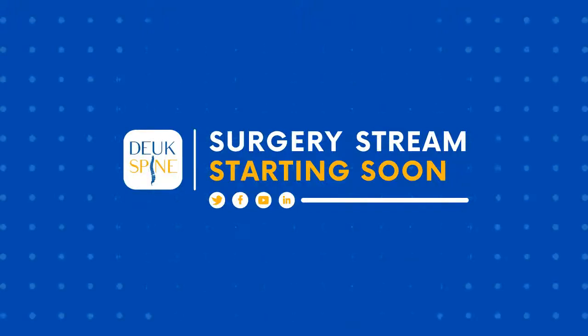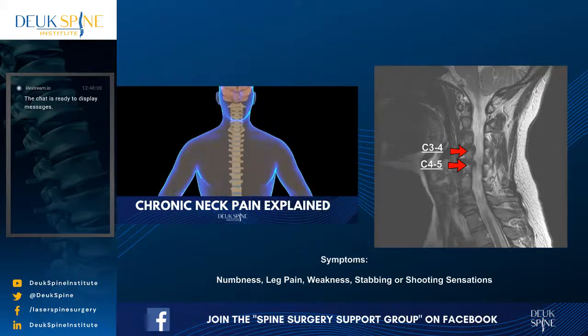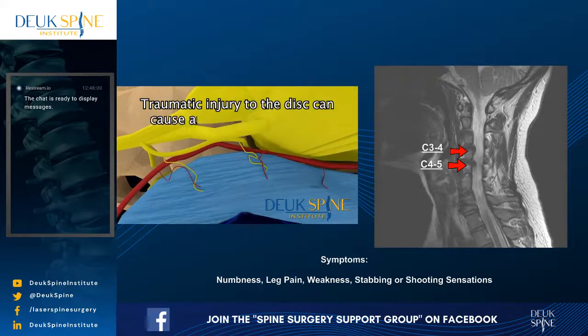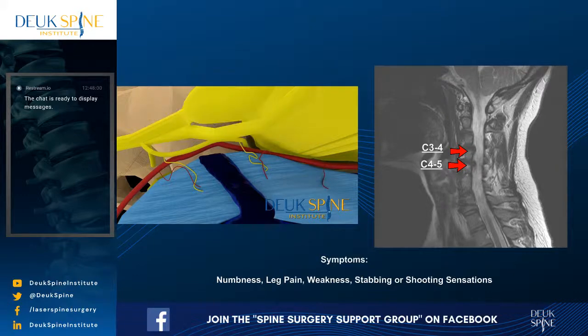We are getting ready to perform spine surgery, and we're broadcasting live to you so you can watch it, ask questions, and be part of the surgery. Our patient is here to have 2 herniated discs in her neck fixed, and she's already had fusion done in the past on her neck. This is a case where she's developed what's called adjacent segment disease with herniations above the fusion. And so we're going to try to fix those for her without doing more fusion.